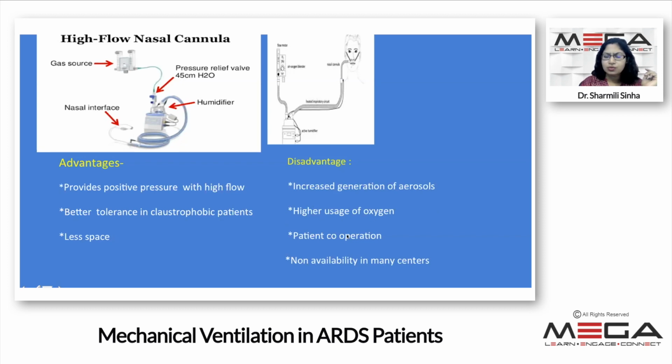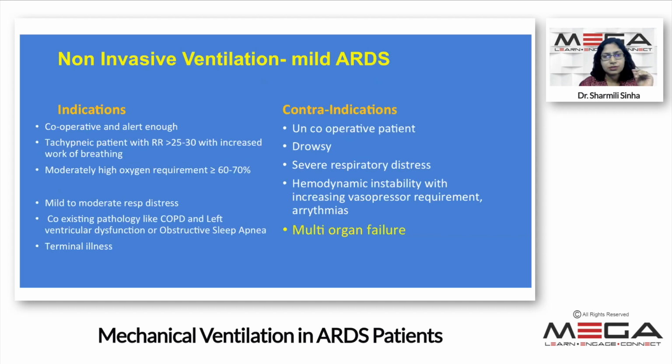Many patients also do not cooperate because the higher amount of flow which is generated at the nostrils makes the nose very dry. So many patients also do not feel comfortable, and if the humidity is not appropriate, if the temperature is not appropriate, they may not feel comfortable. And due to the cost, it may not be available in most of the peripheral or the smaller centers.